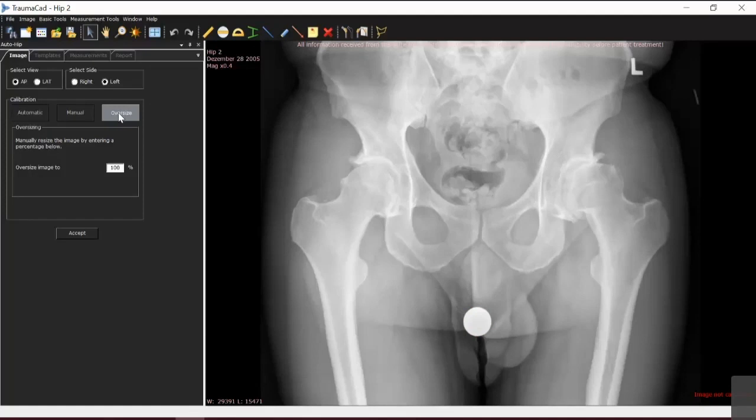The additional information that you as a surgeon would have, not just the X-ray in front of you, but you also have the benefit of having the patient, not necessarily in front of you at that time, but during the clinical workup, you'll have seen the patient. So if the patient's very slim, it would be a fair deduction that the magnification factor would be less.